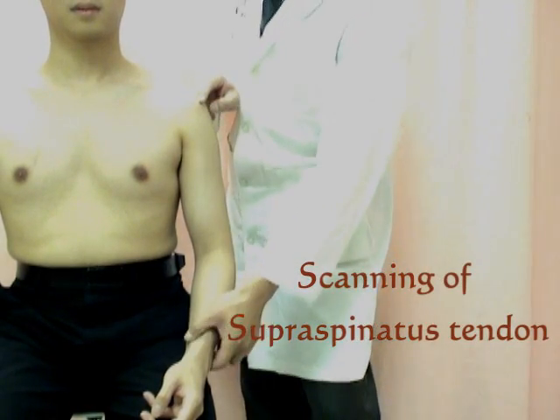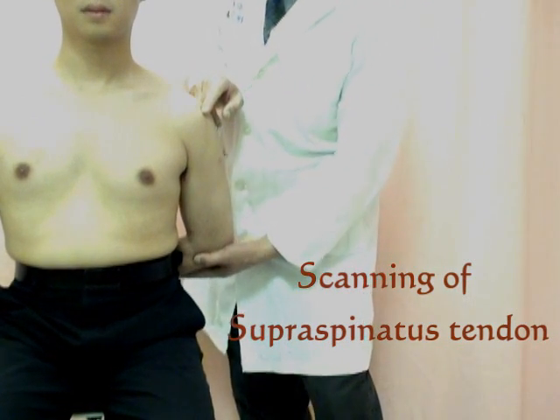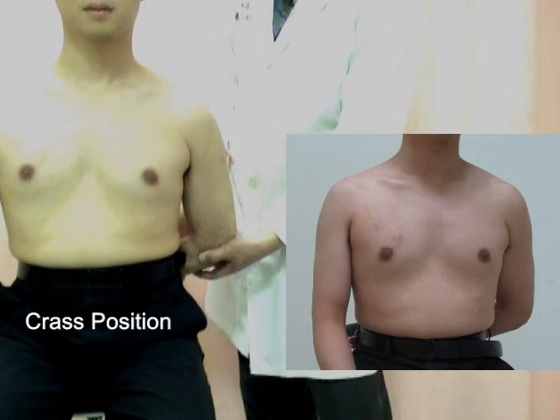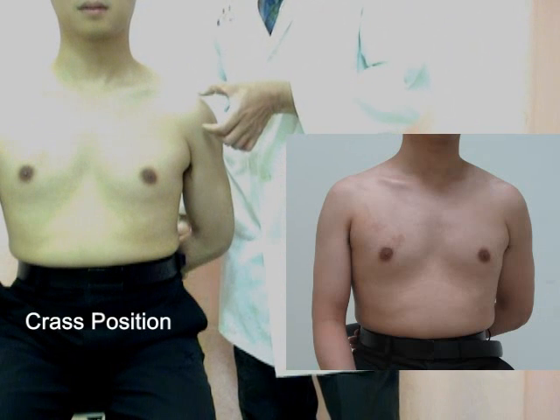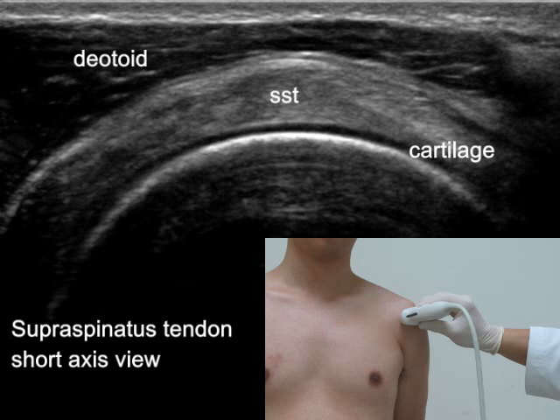To get the picture of the supraspinatus tendon, move the patient's arm into internal rotation position and put the patient's back of the hand on the buttock. The long axis view of the supraspinatus tendon can be imaged from the anterior part of the shoulder. Put the transducer in vertical position — the tendon can be seen as an echogenic beak-shaped structure. Turn the transducer to a horizontal position and we can see the short axis view of the tendon.